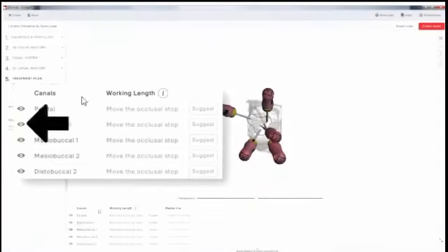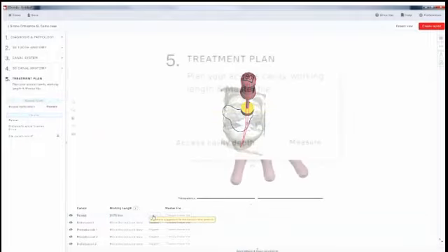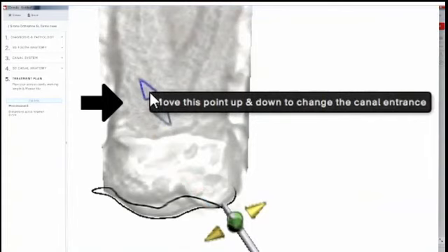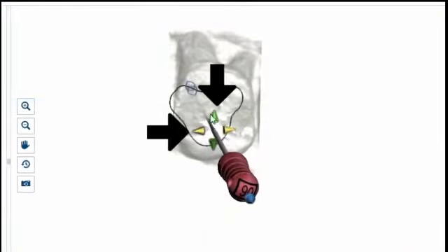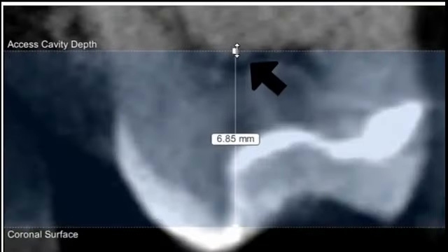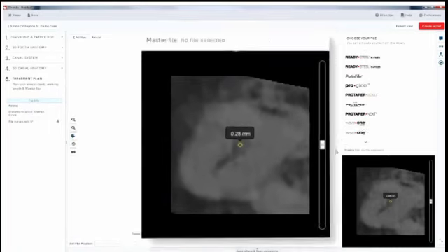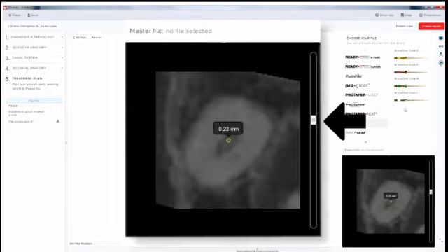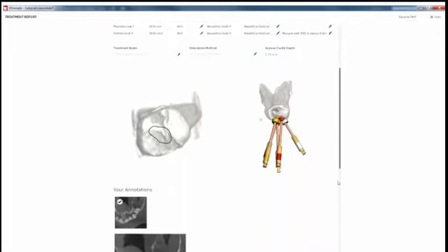The next step is estimating working length, which can be done by clicking the suggest box. You can also move the stopper and move the file to a more straight-line axis to get the working length accordingly. Canal entrances can be changed, and you can also know the access cavity depth for easier penetration of instruments. You can choose the master file from a library as per size, know the actual canal diameter and the apical width, and generate a report with the corresponding master apical file, saveable as PDF.